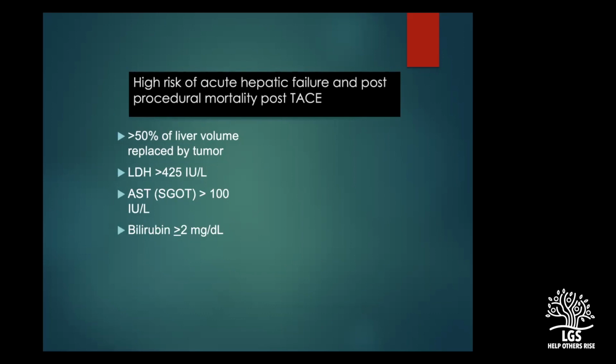We have got really small microcatheters. We can reach very close to the pseudocapsule of the tumor. So what they say in the literature right now probably doesn't hold true, because they say with bilirubin of more than 2, you're not supposed to do this. But I still go ahead and do it, because we have really small microcatheters and we can be very super selective. And I think the individual abnormalities of these parameters have not been shown to predict the adverse outcomes of chemoembolization.